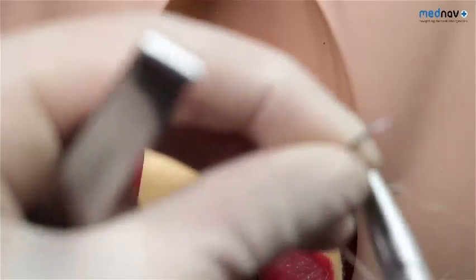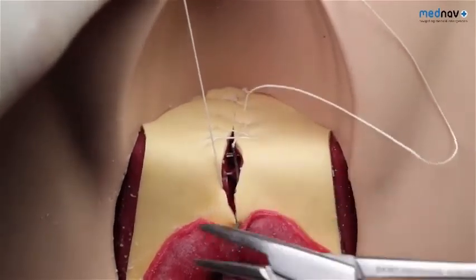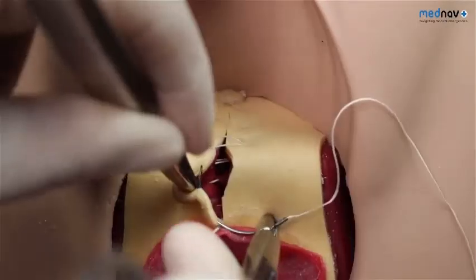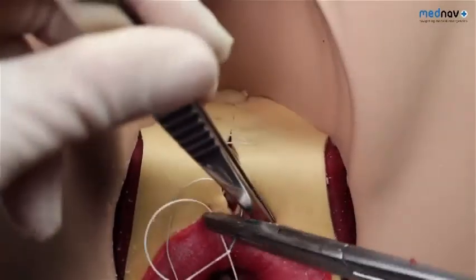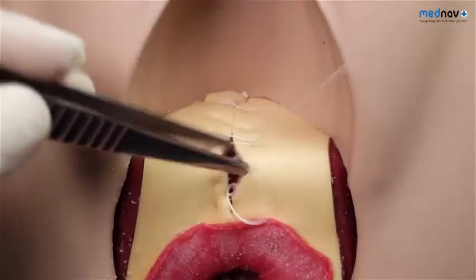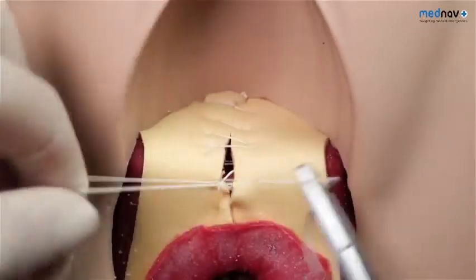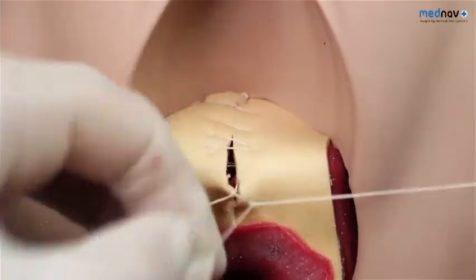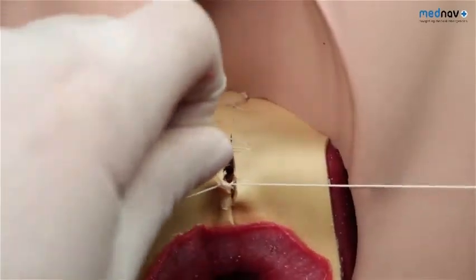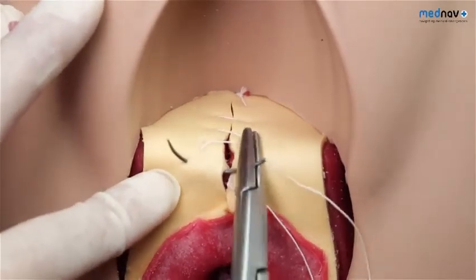By this point, haemostasis should have been achieved. Bring the suture out at the apex of the skin and close the skin using subcuticular sutures. Use a loop or Aberdeen knot at the posterior fourchette to finish the procedure. Subcuticular sutures are associated with less pain than sutures that penetrate the skin. Remember not to use any undue tension as this can result in chronic pain. Finish off the procedure by counting your swabs and equipment and carrying out a vaginal and rectal exam to ensure adequacy of the repair and that no suture is palpable in the rectum.